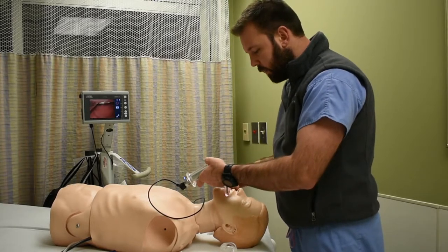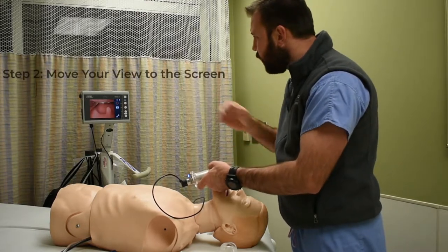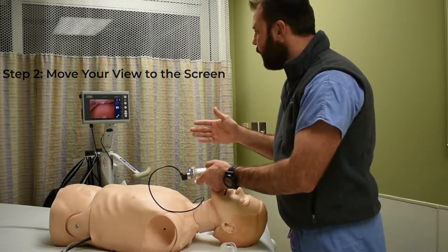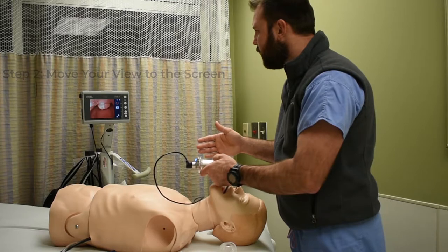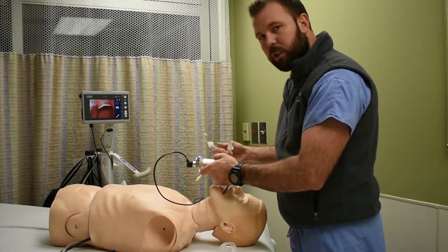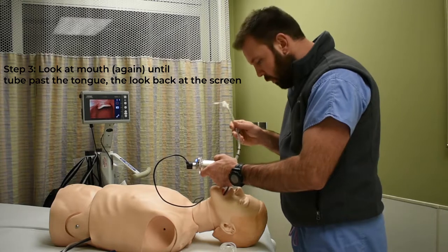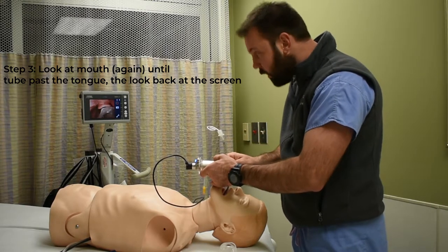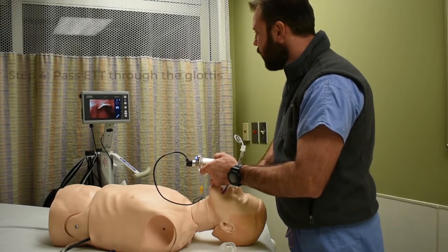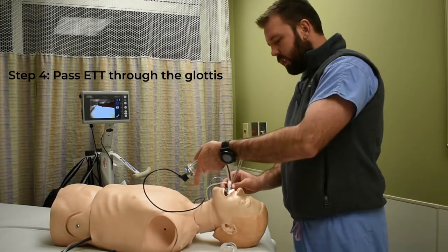Once you're past the tongue, transition to step two: move your view to the screen. We have little reason to look down into the airway at this point — use the screen to identify airway structures and navigate a view of the glottis. Step three goes back to looking in the mouth, similar to step one — we don't want to cause trauma with our tube, so make sure you're getting past the tongue, then transition your view back to the screen. From there, pass the tube through the cords, and you've successfully intubated the patient.